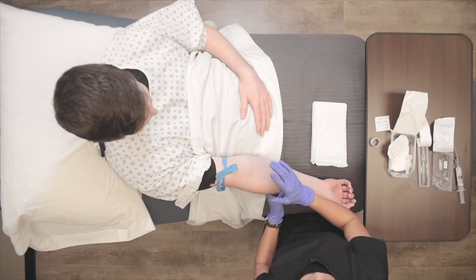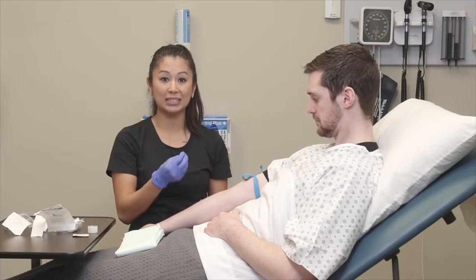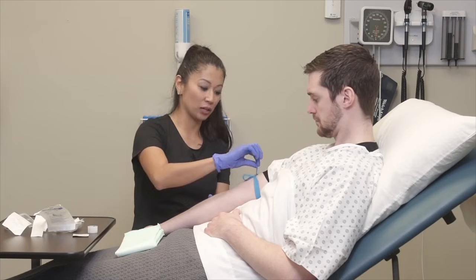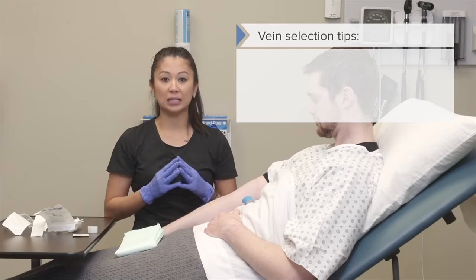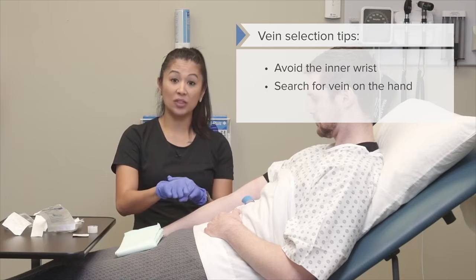So when we're doing this, you want to make sure you palpate that vein and it's nice and bouncy. Once we've identified that site, we want to release the tourniquet. So I'm going to go ahead and release that so we can give his arm a break. So again, just to talk about vein selection, avoid the inner wrist. There's some great ones on the hand.